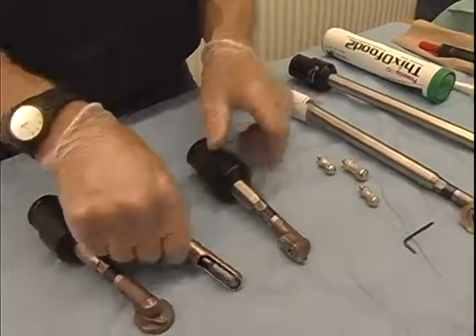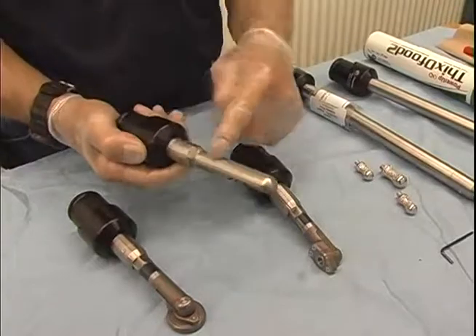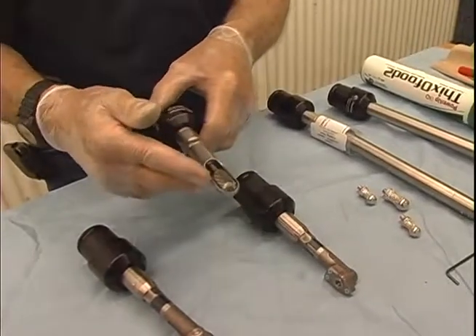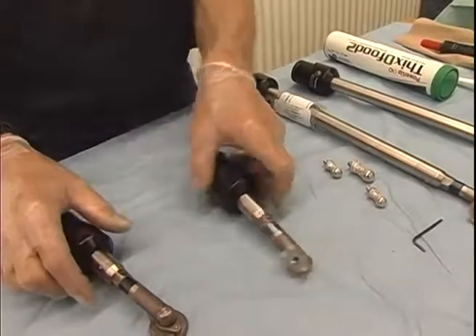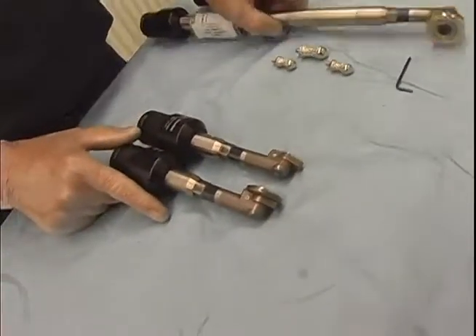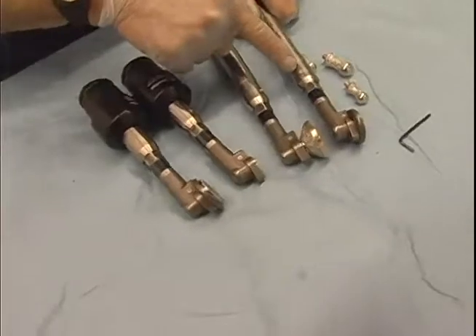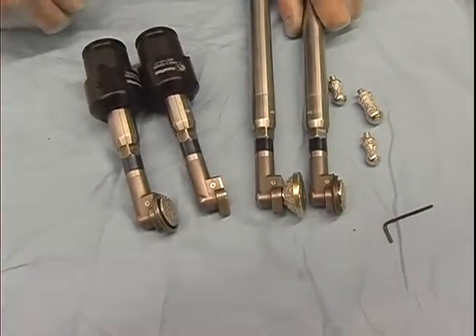This is a straight rotary, so there are no grease ports on it. No greasing is necessary because the bearing is back in the shaft, and there's no reason to grease this. Every one of these right angle gear systems, long or short, requires greasing. And each one has two grease ports, one on the shaft and one near the gears.